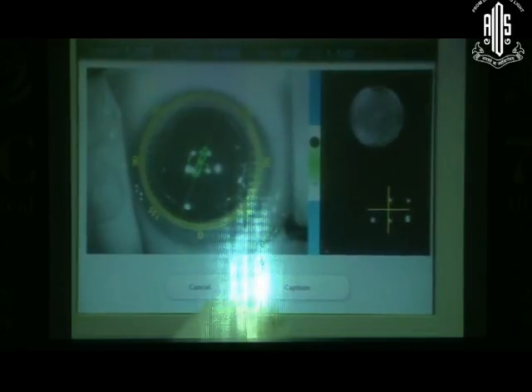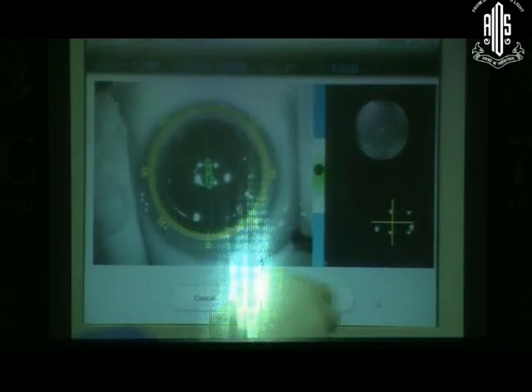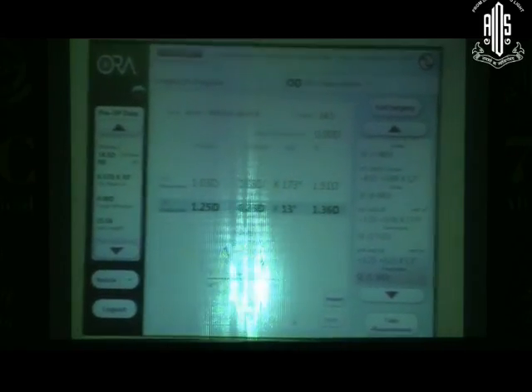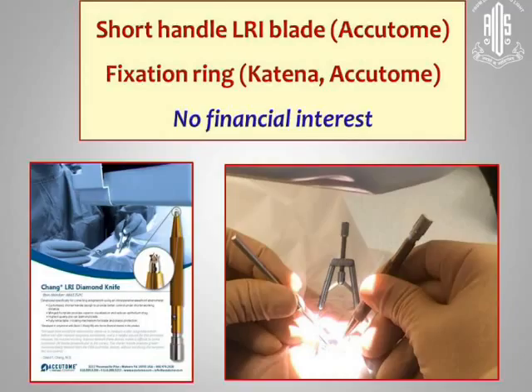So I'm going to go ahead and I made one incision. You can see already the cylinder dropped down to 0.29 right up there at the top of the screen. So we're dropping. I lift the speculum up. So I only made that one incision. We're going to do a reading there. So you'll see up the top 40 readings, an average shows up, and now the cylinder went from 0.96 to 0.23. I can stop. This is an actual reading of the keratometry there. So that's the benefit of that. These are the shorter handles that I had talked about.